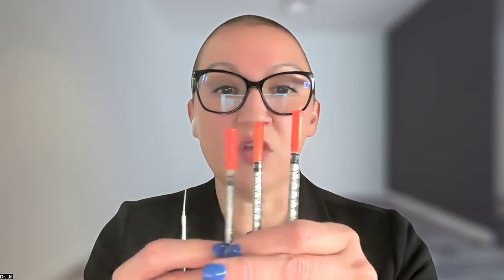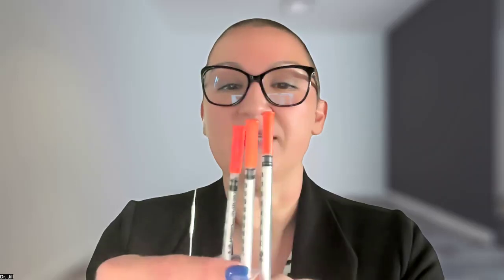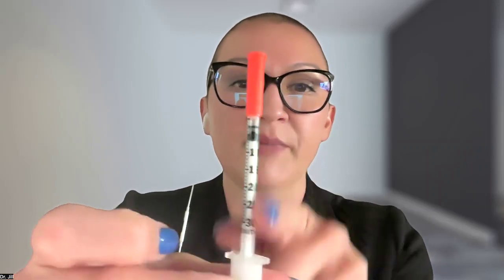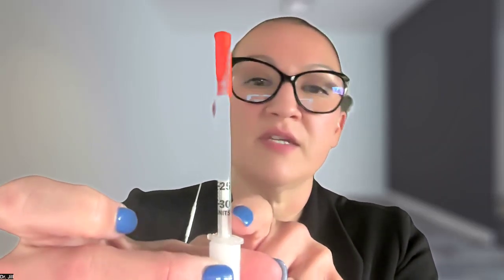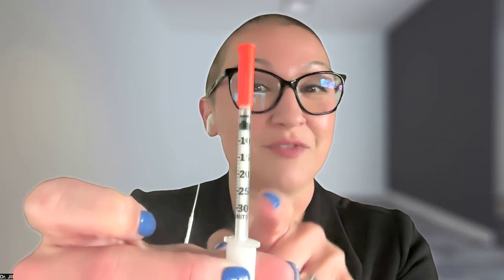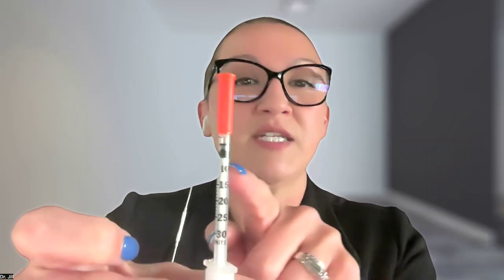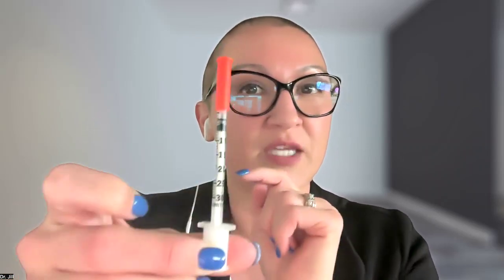And when we want to look at that, we're going to look at our syringes. And these syringes all look very similar. One is bigger than the other. I'm not trying to be a magician here, but they're all very similar, but they're different sizes. So when we're reading a syringe, we're going to look at the barrel. This is the barrel here. And so we can see here, this is a 30 unit syringe. We would not use this syringe to inject 50 units. So this is not the size of syringe that would come with a 50 unit medication. Someone that needs 10 or 20 units, maybe even up to 30 units might use this. But in general, we're not getting 50 units out of a 30 unit syringe.